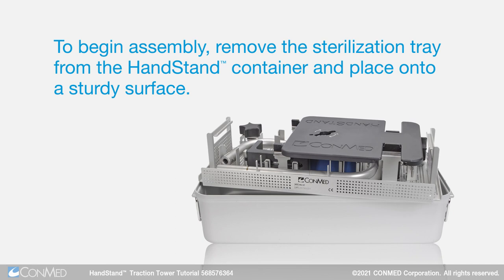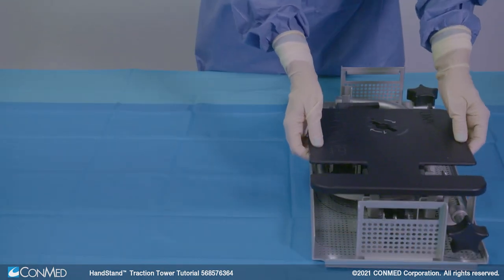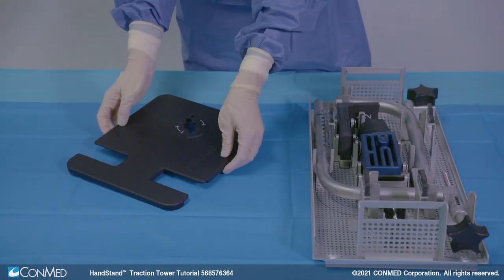To begin assembly, remove the sterilization tray from the handstand container and place it onto a sturdy surface. The tray contains the handstand components. Assemble the tower using the quick connect etchings on each of the components.